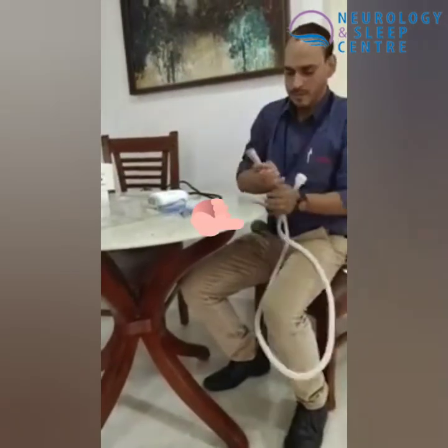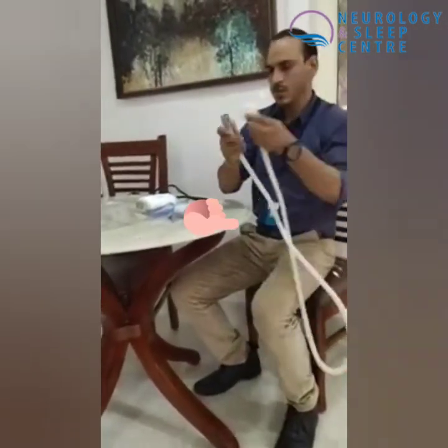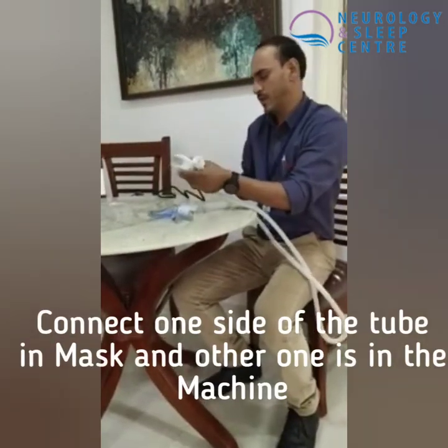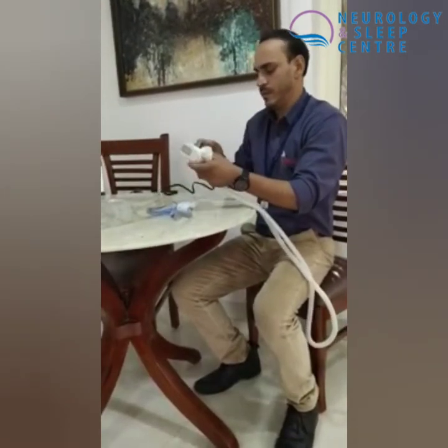This is the tube, and one side of the machine has a mask. This machine has been connected.